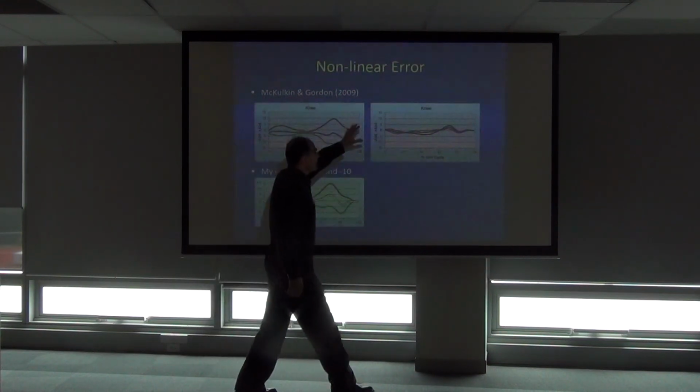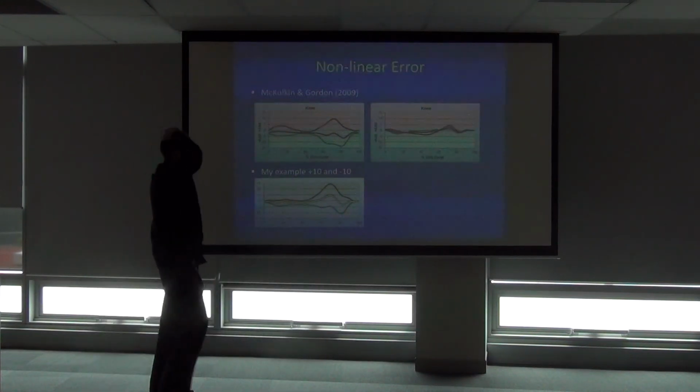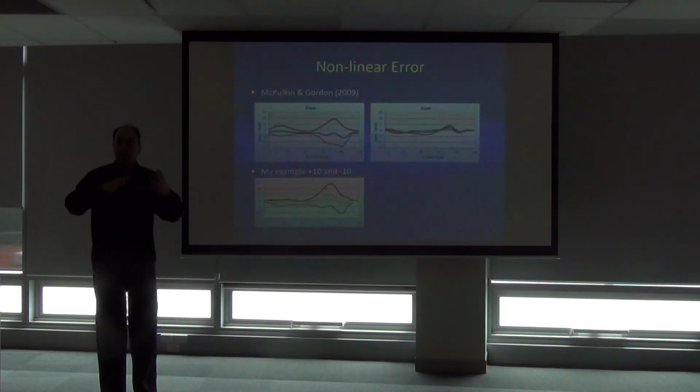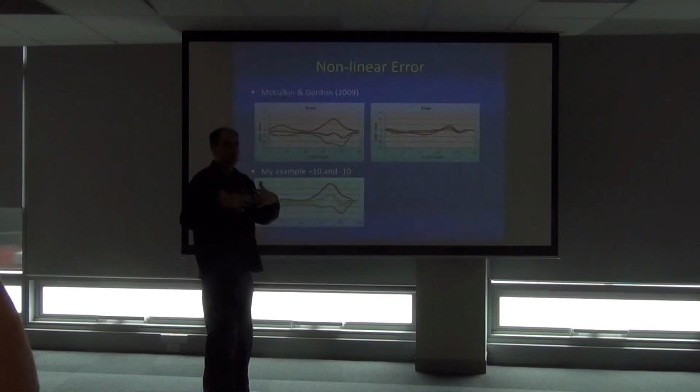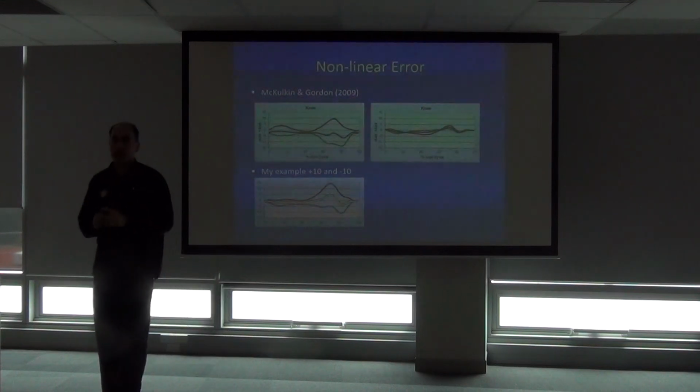So there's more going on here, and maybe there's a deeper investigation to be done on correction, where instead of just an offset, you need some dynamic offset related to skin movement, or the angle or something. But let's see what's happening.